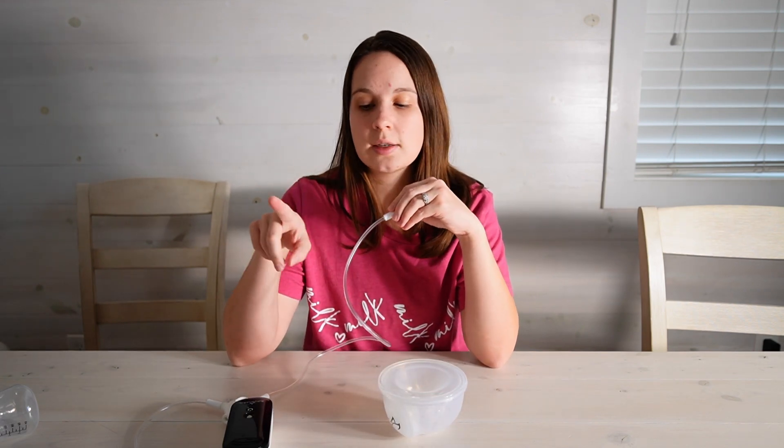When it comes to connecting your pump to the cups, you're going to take this white adapter and just pull that off — you don't need that for the cups. Then right here you just slide your tubing on and you're ready to pump. It's that simple.